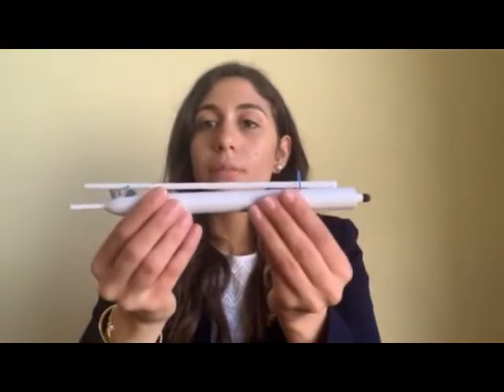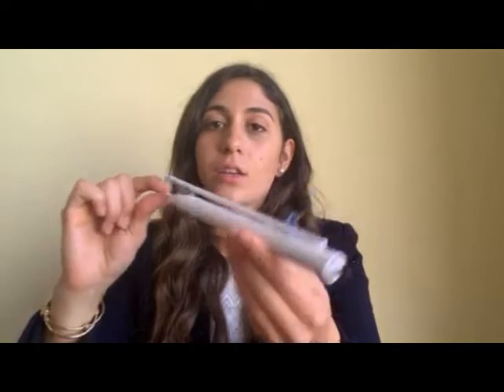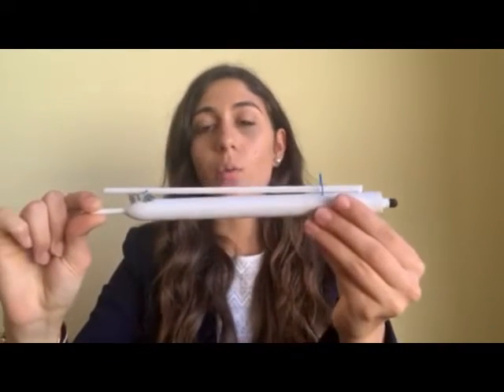What I have designed is a mouth stick that can be adjusted to different lengths so that the patient can reach objects and buttons at different distances from them. Over here is the mouth stylus that can be held by the patient's mouth on this end, and they can use it in its retracted position for objects up to 20 centimeters away.